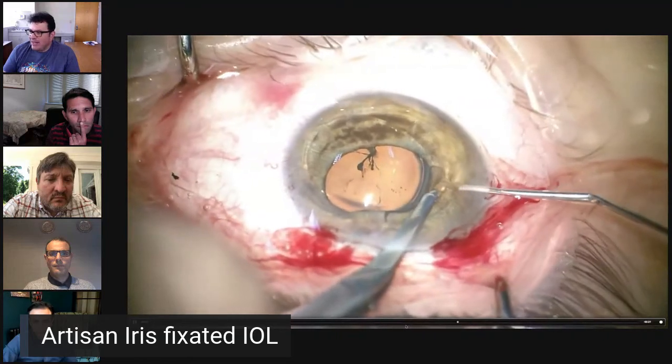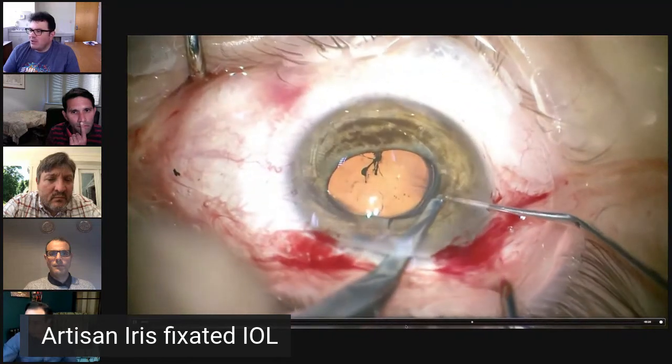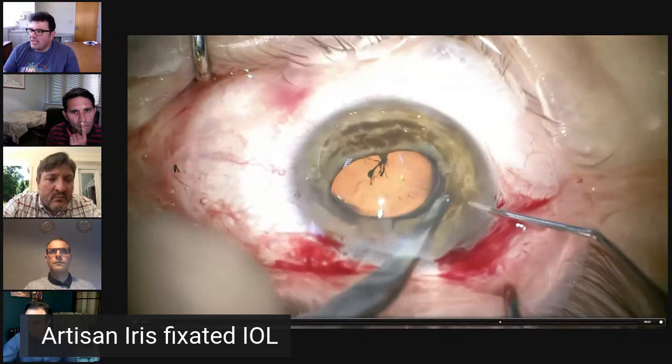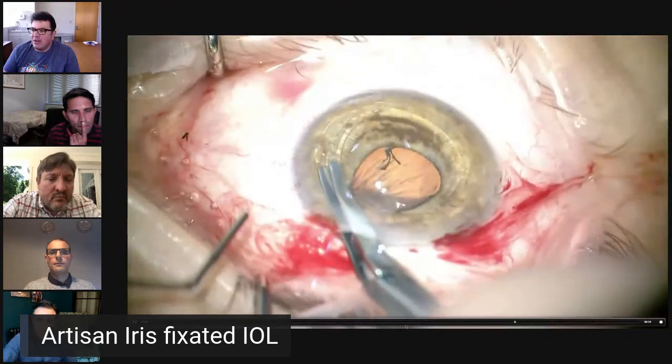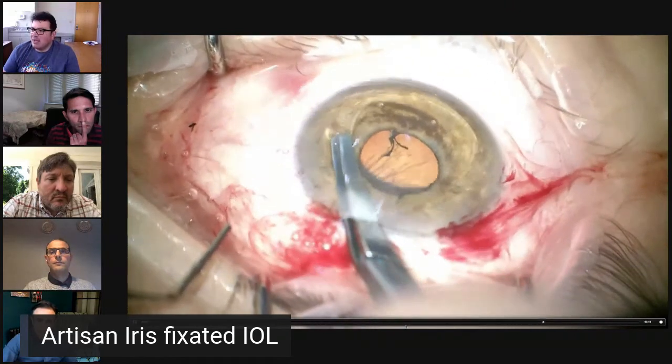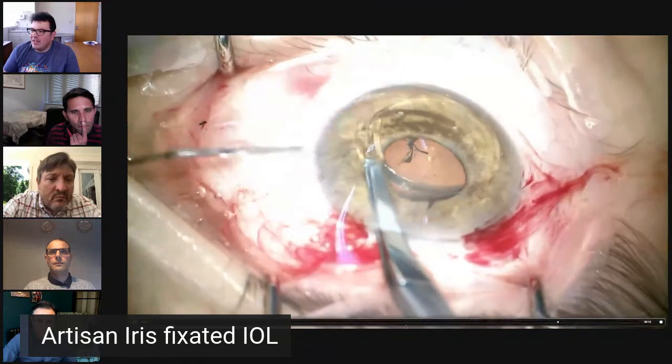Then I figured out that maybe I need to hold nearer. And when you hold nearer, it becomes very easy. So if you need to remove one of these, that's the way to do it. Just hold very near, and then it really will not tilt, which makes sense. But I think until you're shown that, it just becomes tricky.